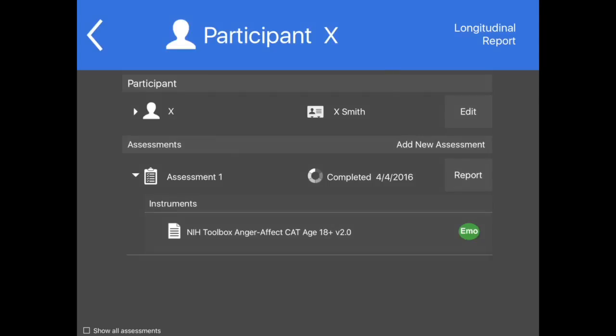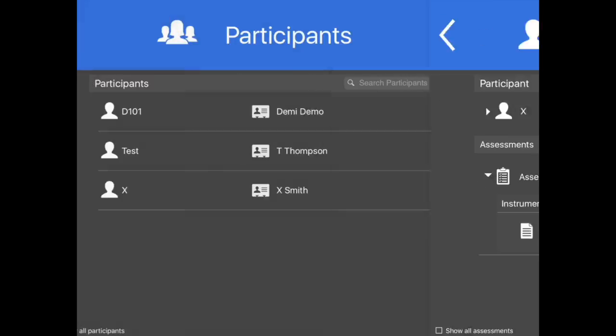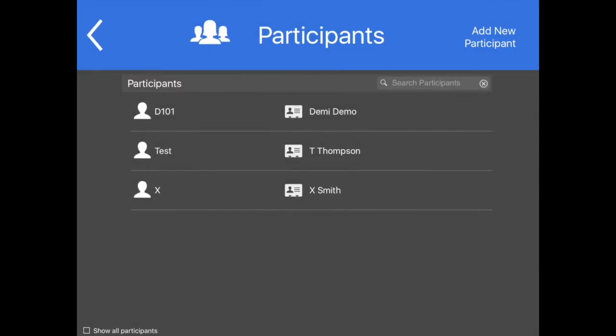If a participant or assessment has been created, but is not desired in the list of participants or assessments, the entry can be archived. This may be useful in managing data after demonstration, training, or practice.